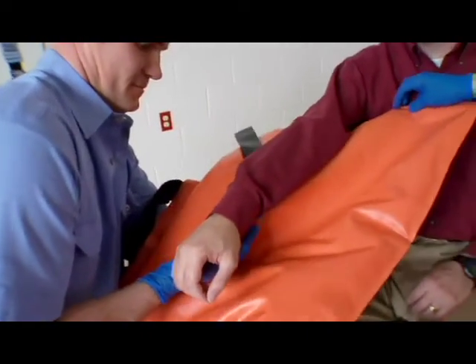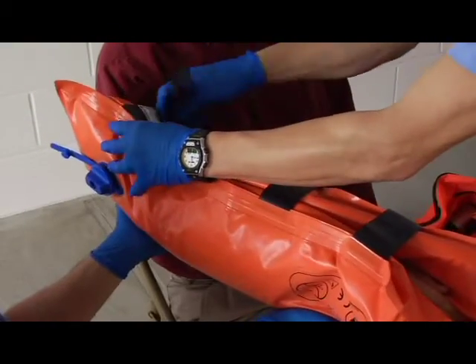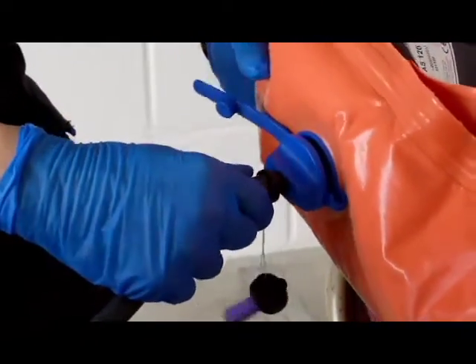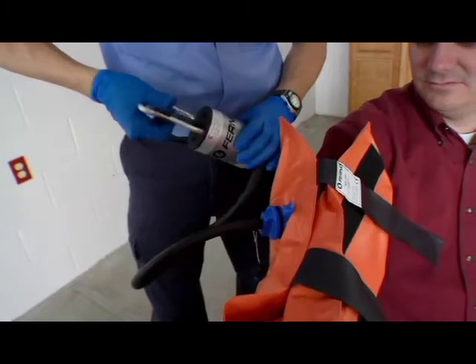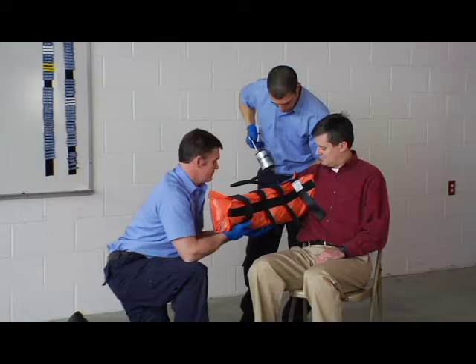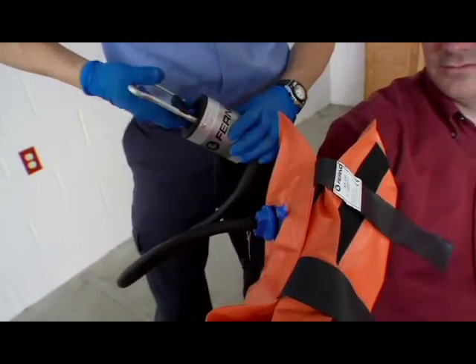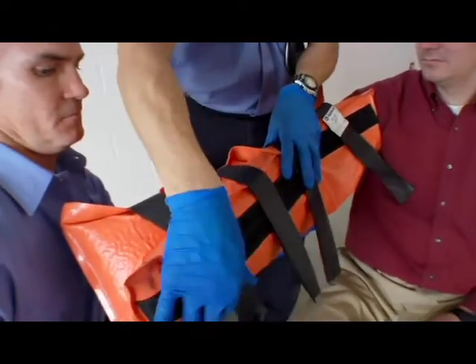Lay the splint flat with the valve upward and smooth the splint to a uniform thickness. Using EMS approved techniques, place the splint around the injury with the valve on the outside. Make sure you have access to the valve. Secure the splint in place with the hook and loop adjustment straps. Connect the vacuum pump to the valve stem. The pump operator begins removing air from the splint by pulling and pushing the pump handle. As air is drawn out, the second operator continues to manually stabilize the splinted area and, if necessary, gently molds the splint to the body. Continue until the splint is as rigid as desired. Disconnect the vacuum pump and tighten the adjustment straps if necessary.